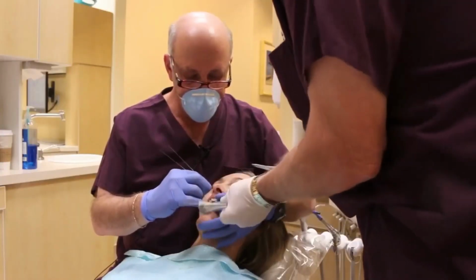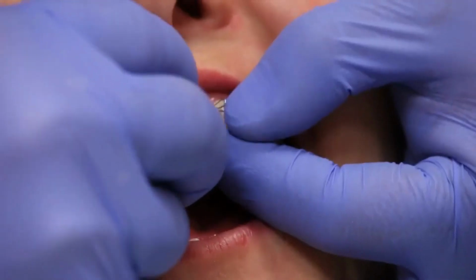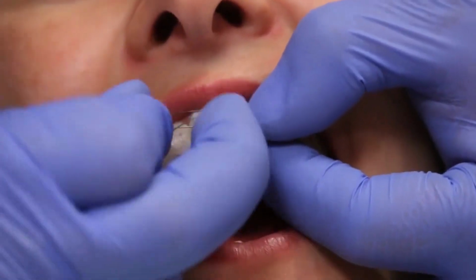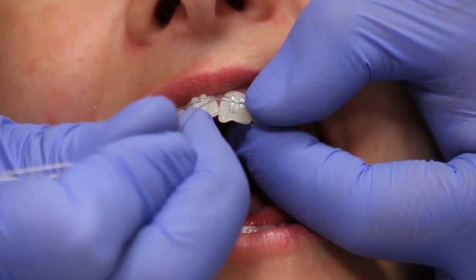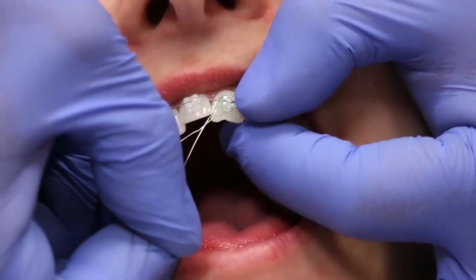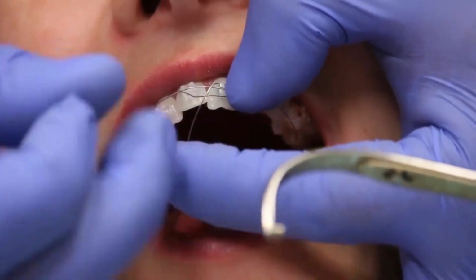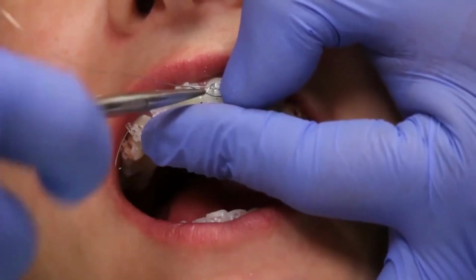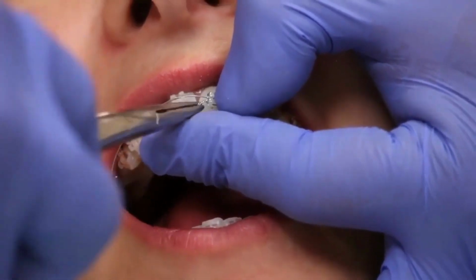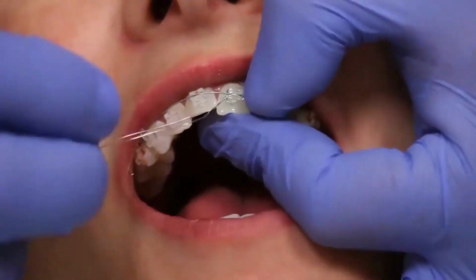Right here. So when the ligature is passed to you, you just grab it, and then you can slide it onto the bracket. Now, once you have the ligature slid onto your bracket, use your middle finger and twist your hand, and you start the twist. Put your fingers over the bracket so it doesn't loosen up. Grab close to the bracket so you don't have to twist a million times, and your first bracket, it's tied.